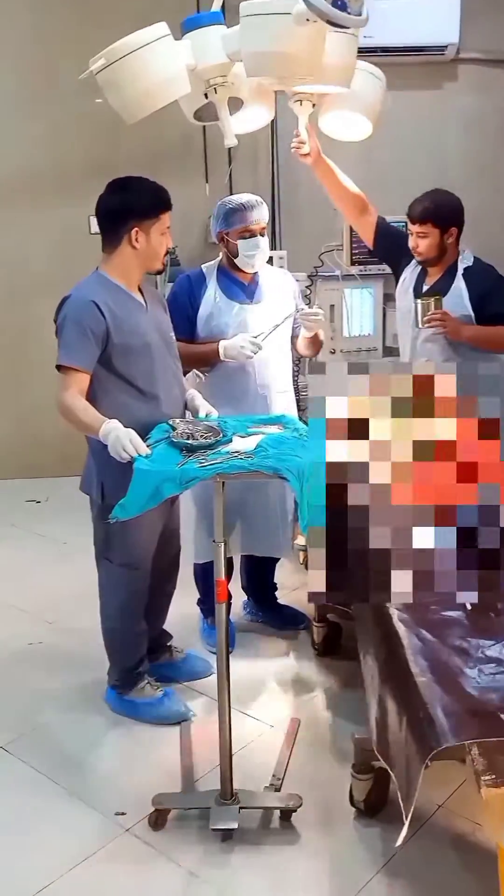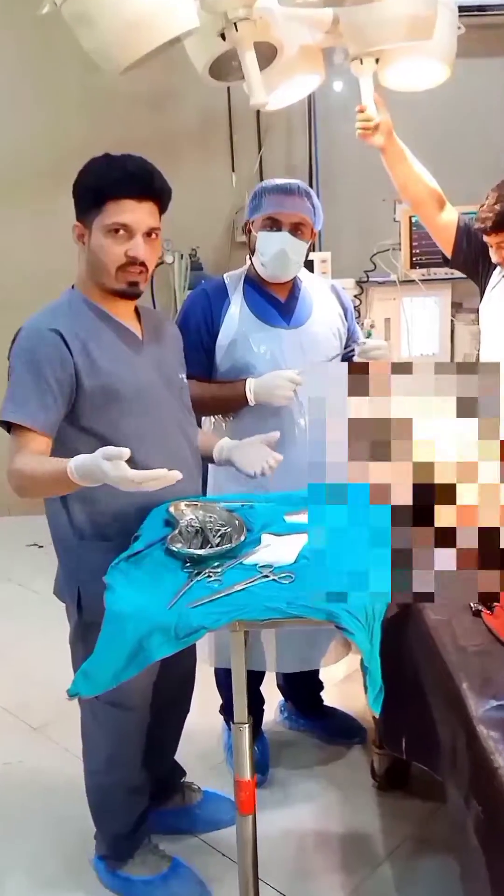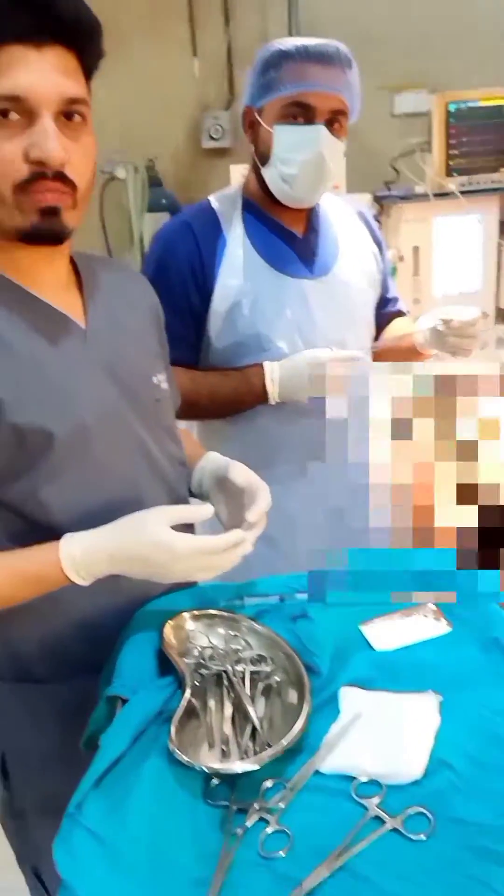Sgt. Dr. Mehmet Glani and Sgt. Dr. Kamran Karim are here, and they will demonstrate how to operate a case of pyogenic granuloma. We have a 65-year-old female patient with pyogenic granuloma on the inside of the lip.